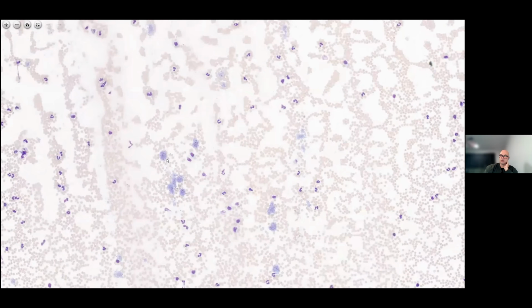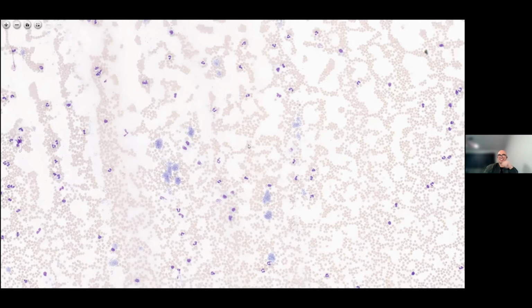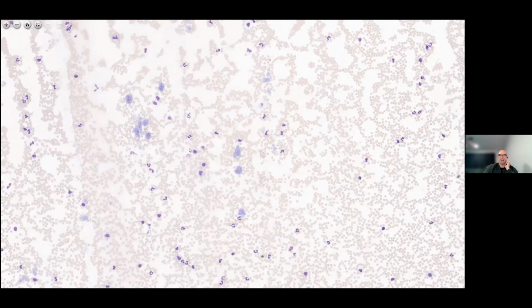Some people are very relaxed about it and will give a qualitative report, like they think there's platelet clumping. Or it might be a hospital lab where you have quick access to a patient and you would organize a recollect pronto, and maybe collect it in conjunction with a citrate sample, or run a new blood tube.